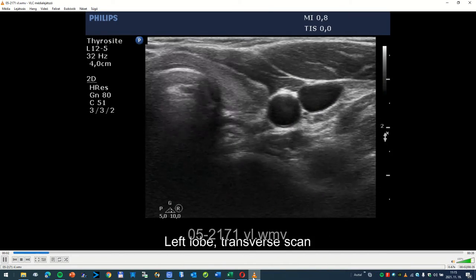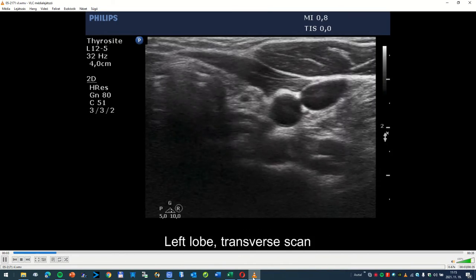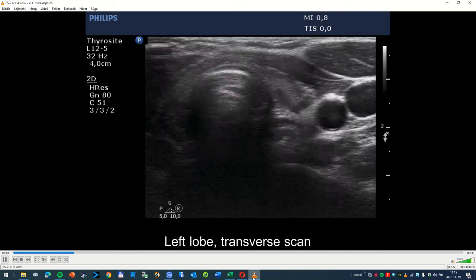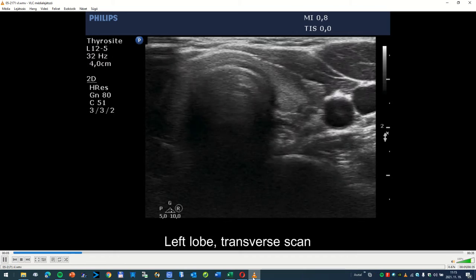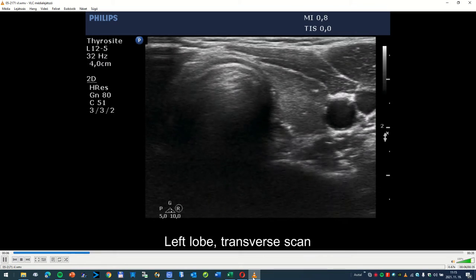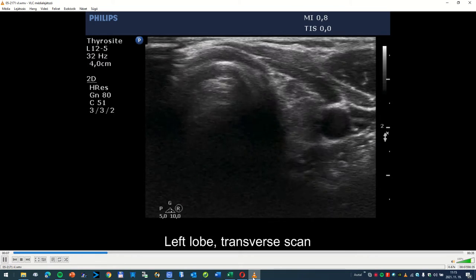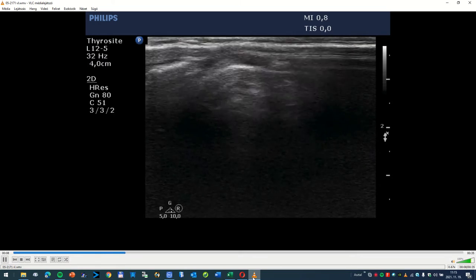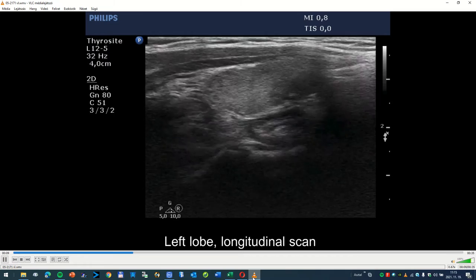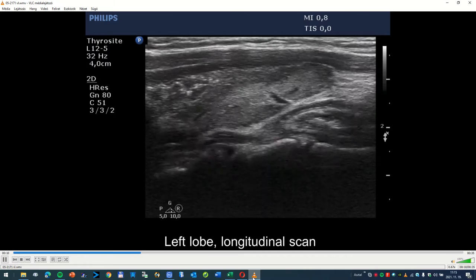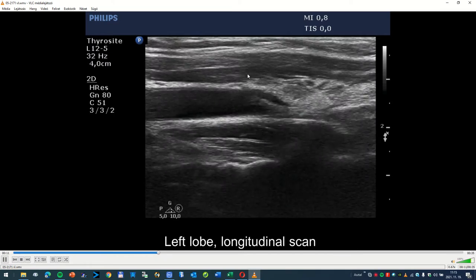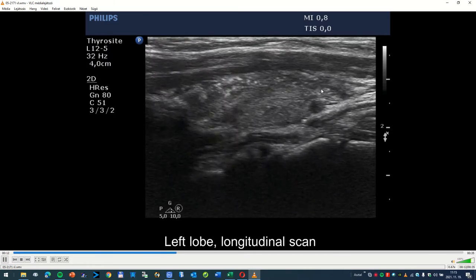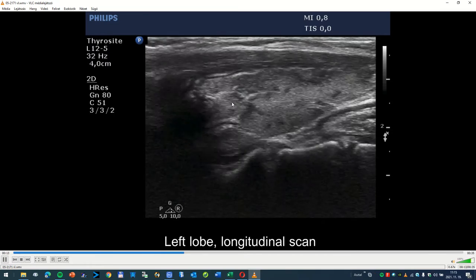Now I present a very edifying case. What we see is the focal form of Hashimoto's thyroiditis. This patient was hypothyroid, but on a longitudinal scan here we see this pattern.